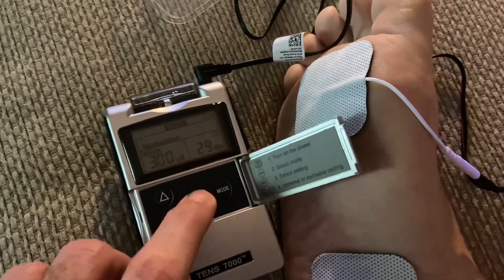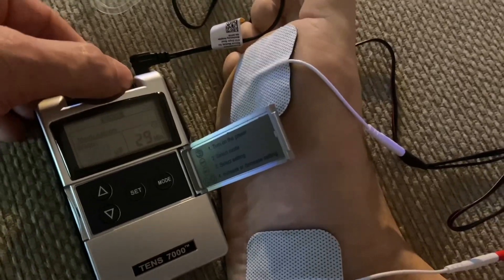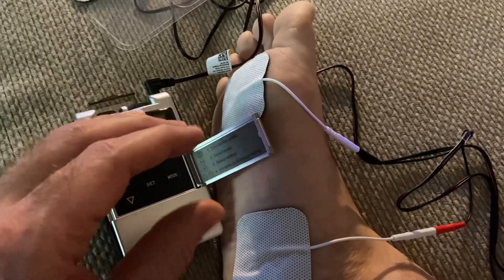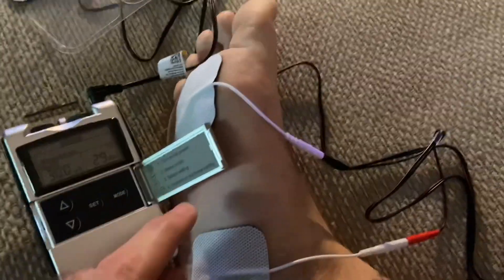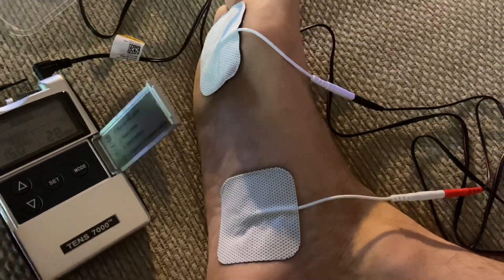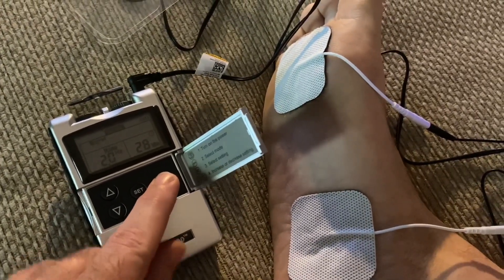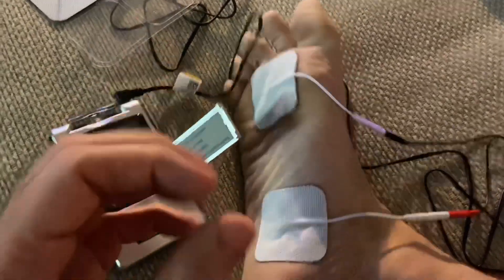Let's try a modulation mode and see how that feels. I can feel it pulsing right now — that's what the modulation is doing. Now let's change it to burst mode. Now it's really fast bursts.